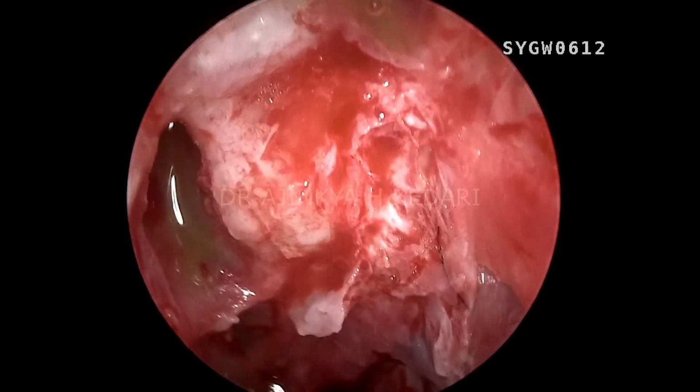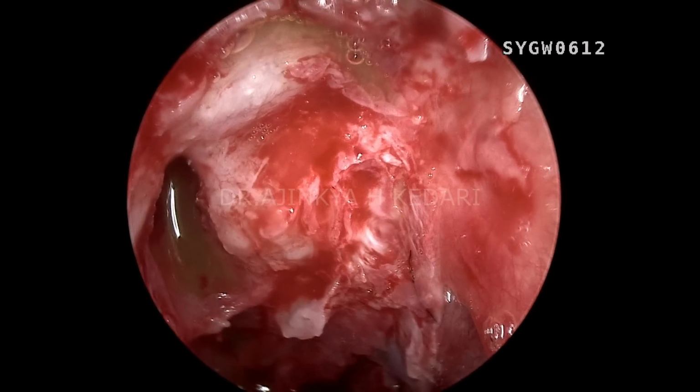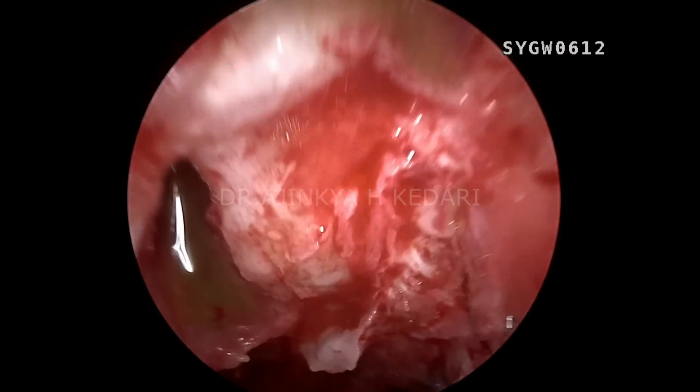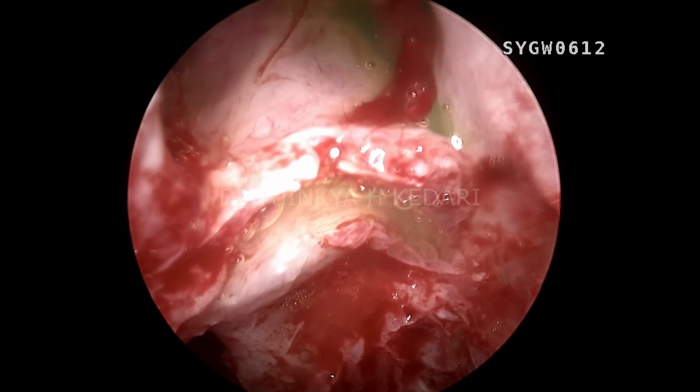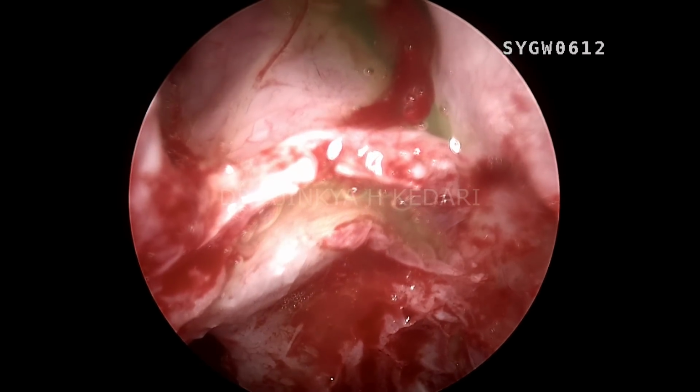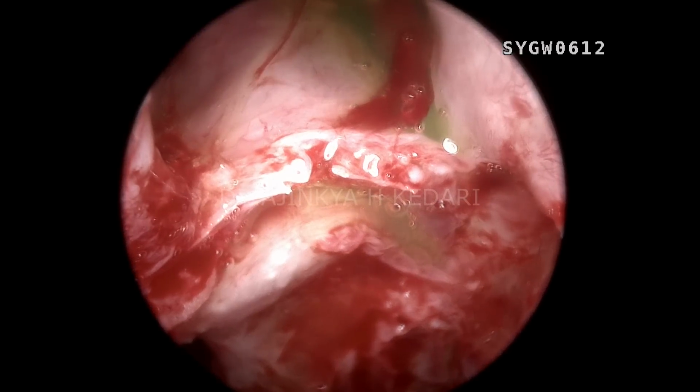So now comes this. You can see that's the second site of the leak, way posterior towards the posterior ethmoidal skull base, more towards the lamina, and that is the frontal sinus base. You can see a lot of CSF leak happening from up there. That's a huge opening, but beyond this, we need a head-on approach.